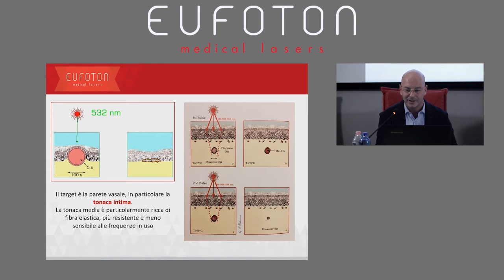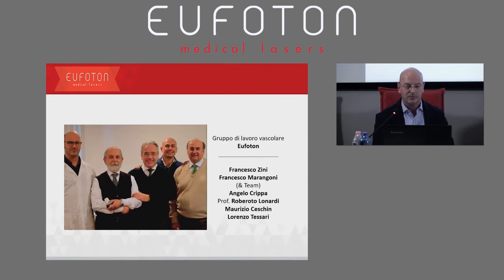We have already seen a few slides about these Eufoton historic pictures. Dr. Kripa quoted them and showed them to us before. So monofrequency 532 for superficial vessels with thin walls. This is a procedure that really works, even though we only have one frequency, as you said.